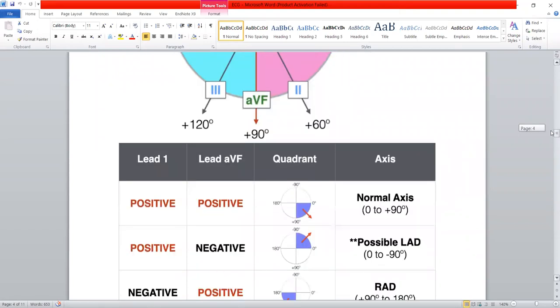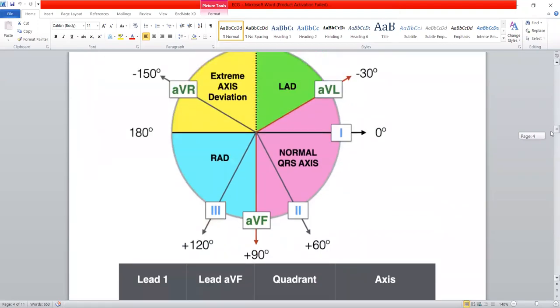In the second situation, the QRS complex is negative in AVF. This means the current is flowing away from AVF in the upward direction. And it is positive in lead one, so it is moving towards lead one and upward away from AVF. The axis will deviate further to the left because the current has changed its direction due to some pathology in the heart. So this will be left axis deviation.